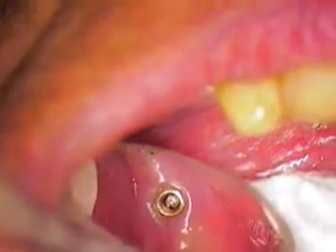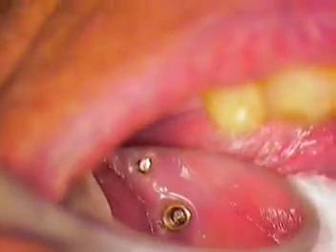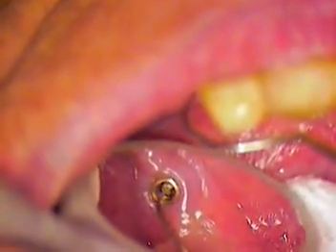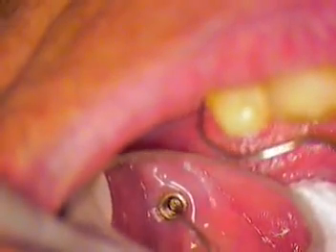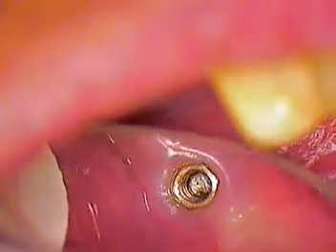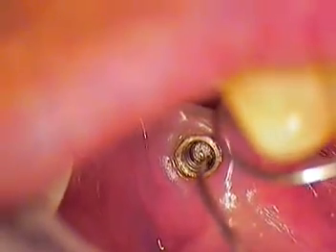That solvent acts as penetrating oil, but it's not really an oil. It's a true solvent used to remove tartar and stain. There's a lot of tartar and bioburden located within the threads themselves. So instead of trying to force a thread, what we'd like to do is dissolve what's in front of it and then it'll back out nice and easy. We did not slot anything in here. We didn't use any heavy instruments. We want to preserve the inside as much as we can and keep it from being marred or scarred in any way.